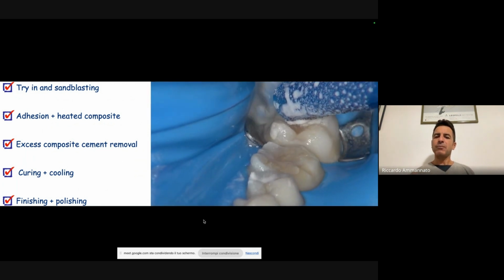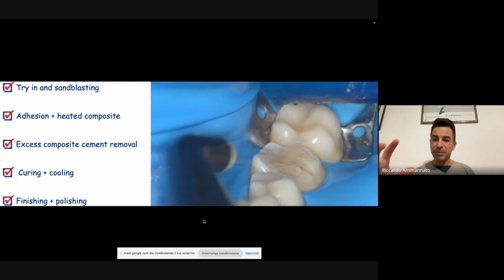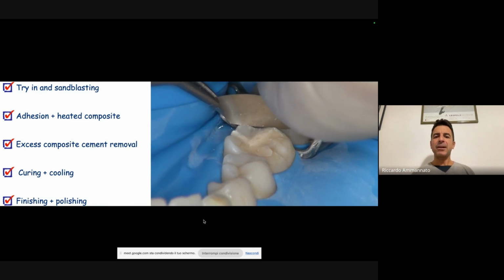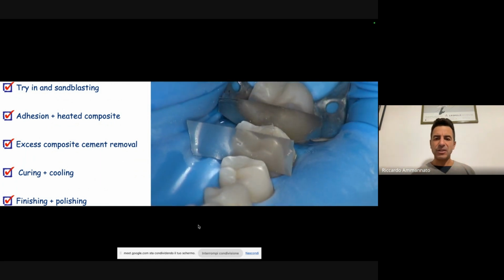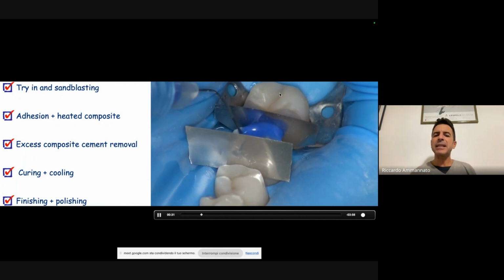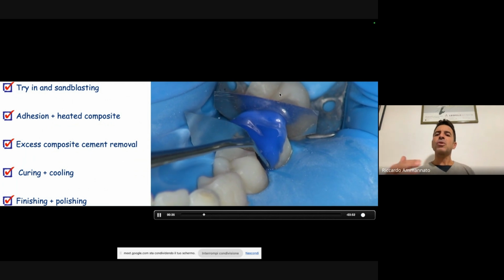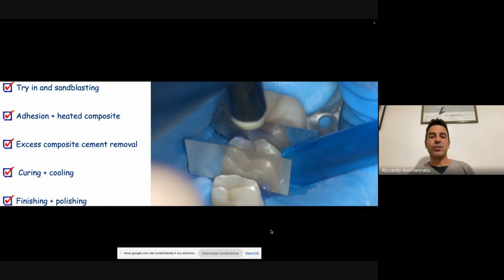And so I'm doing the cementation, but before, since I want to go and do my sandblasting, here I'm placing just matrices, or you can place Teflon to protect your adjacent dentition. You see here the two premolars and the second molar that are the ones that I molded previously. And now I'm going to do my adhesive procedure to go and cement my glass ceramic restoration.